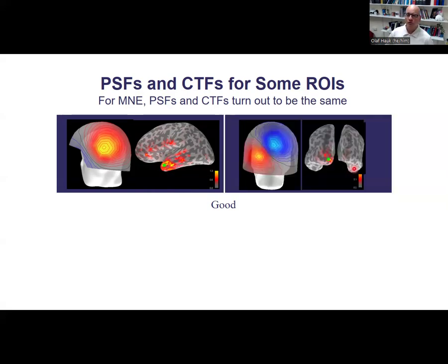If you're interested in occipital cortex, then I think you're usually quite happy. You will be quite happy with MEG. It's well covered. So this source is completely sampled very nicely here. You are close to the sensors. So that means here these two peaks are actually quite close to each other. It's quite a nice topography.